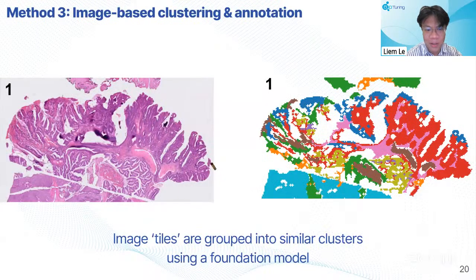Yeah. That looks very beautiful to me, but I have a question though. What if I do not want to do image segmentation on all the tissue, but I am actually interested in a spot which you can see on the slide, I believe. Mhm. So you can press the arrow to the right and it should show an animation. Yes, this spot right here is what we have found in previous methods to contain perhaps the transitioning of epithelial cells and cancer cells. Can you somehow pick out certain cell spots and find other similar cell types? I believe you can do this too, right?